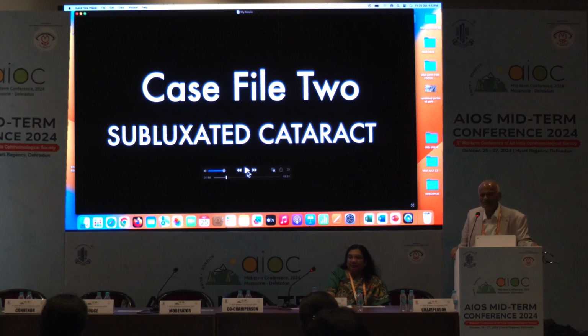What are you going to do? You use 1 ml, 2 ml you are throwing out. So the price is the same. So use it at 3 places when you are doing a mature cataract, when you are doing a nuclear cataract, and once you do that, what will happen? On the second day your cornea will not have much SK, less SK, and the patient is good. So it is always better to have this habit, and it is SOP. If you put visco after 2 pieces, and again after the other 2 pieces, then this will not happen.